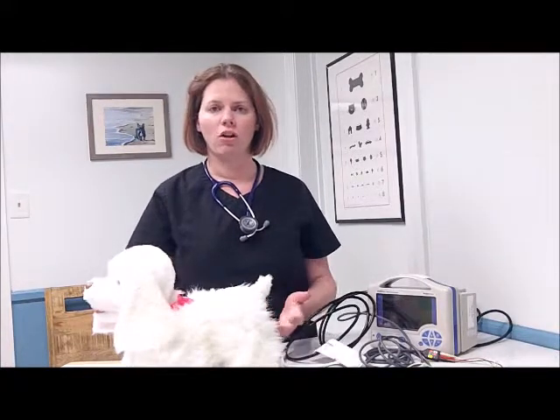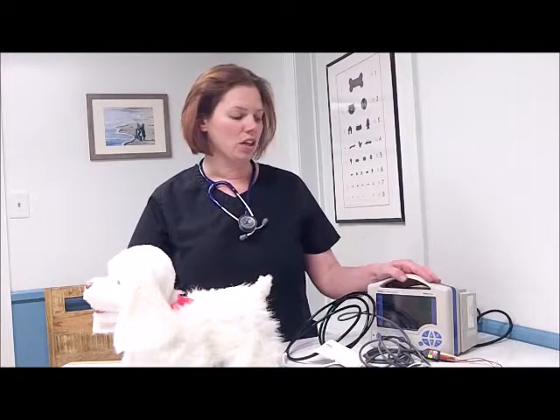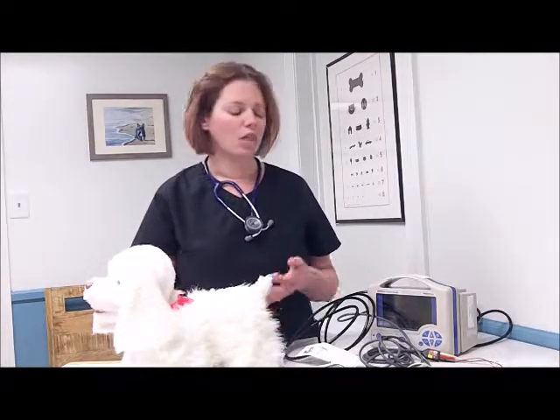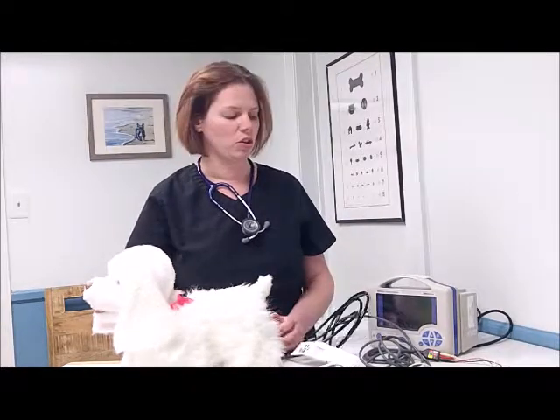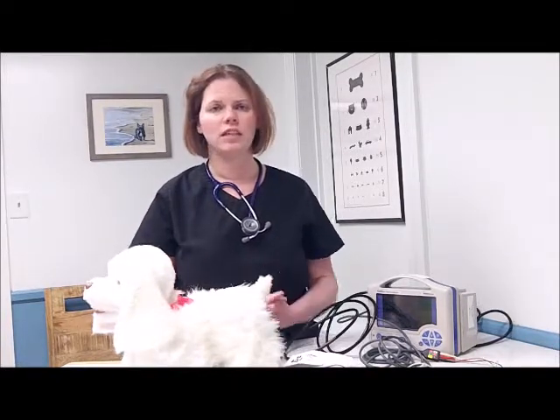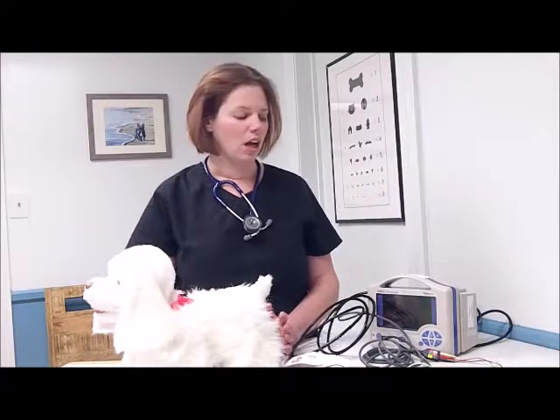First two that come to mind that could be the most critical are heart rate and respiratory. Is my patient breathing? Is my patient's heart beating? The ECG, most machines will be able to tell you, they'll give you a number, a heart rate, which is beats per minute. They will also show you the ECG, the electro part, to show you the rhythm. Normal sinus rhythm is what we want to see in our patient, with a nice, strong, steady heartbeat. Changes in that can indicate problems with our anesthesia or with our patient.